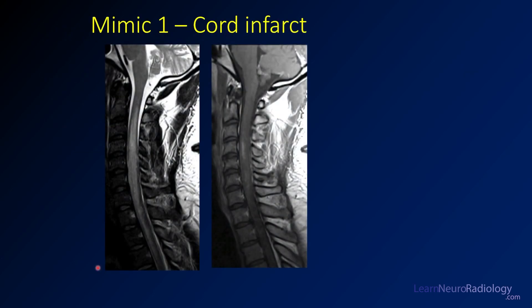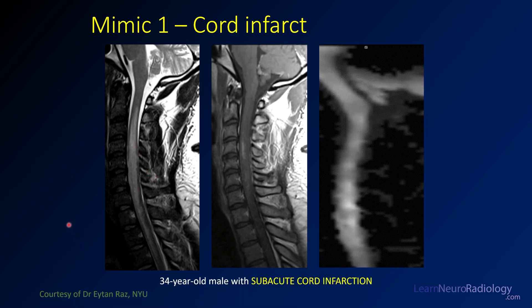Our first mimic is a cord infarct. We have a T2 abnormality that goes from C2 down into the upper thoracic spine. On post-contrast imaging, there's a little bit of wispy enhancement. It doesn't really look like there's a focal mass-like component, even though the cord is a little bit expanded. On diffusion imaging, you can see patchy abnormal DWI signal in the center of the cord.